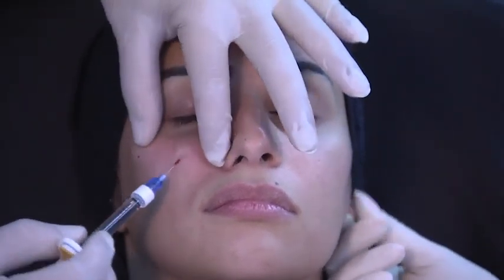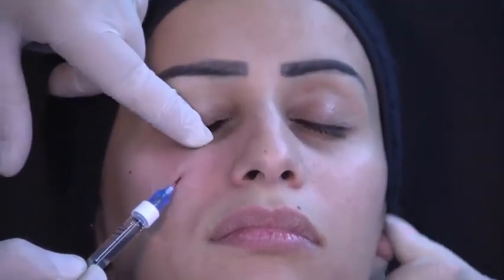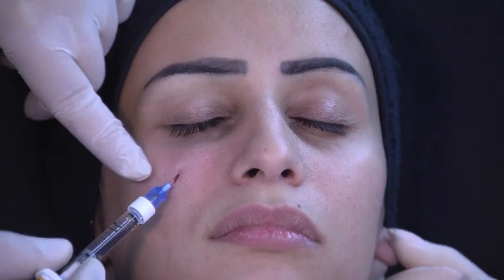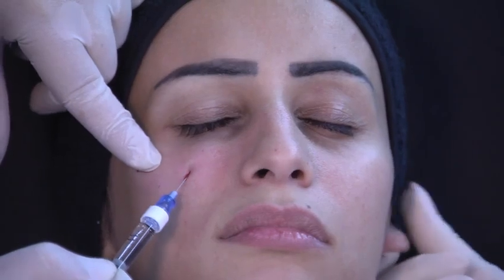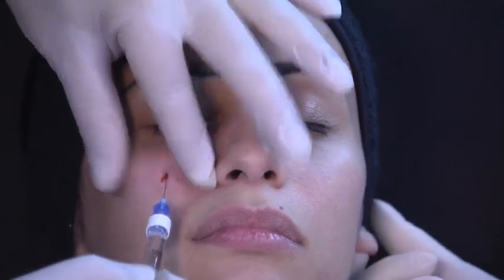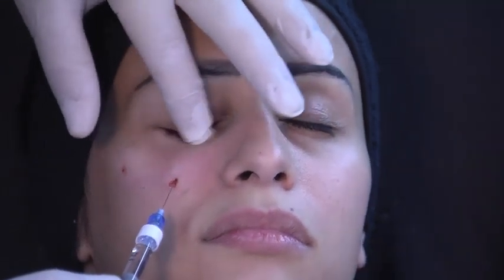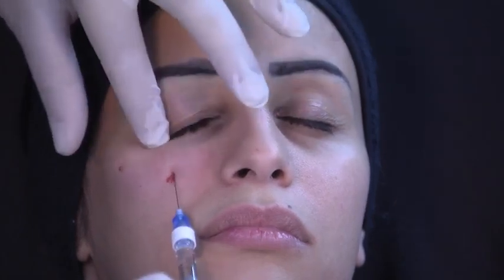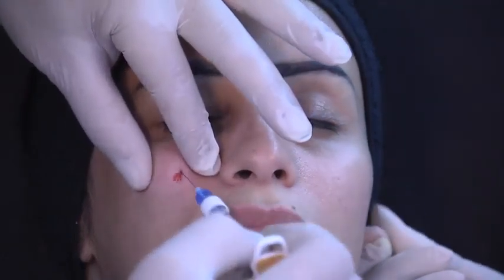Can you close your eyes? Now I'm going to do a small aliquot, and I can see how the skin is starting to lift in this area. Okay? 0.1. Now I stop, I move backwards, and I go a little bit more lateral, 0.1. Don't move, Victoria. Okay? Now lateral, 0.1. I'm doing 0.1 deposits above the orbital rim. Now I'm going a little bit more lateral, 0.1. You can see I'm here. And I can also go more lateral to the palpebromalar groove.